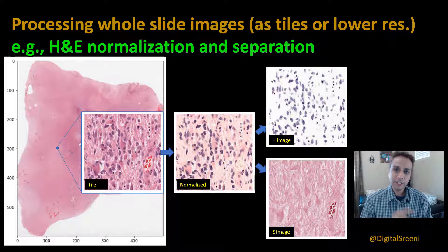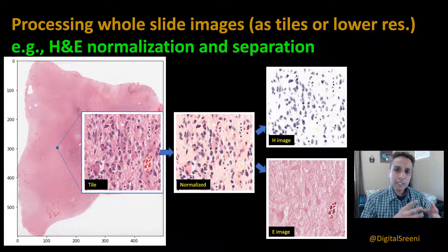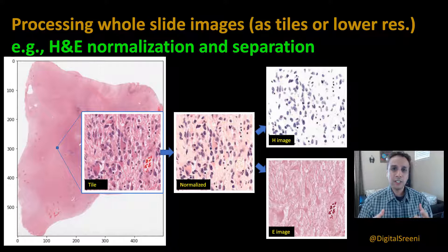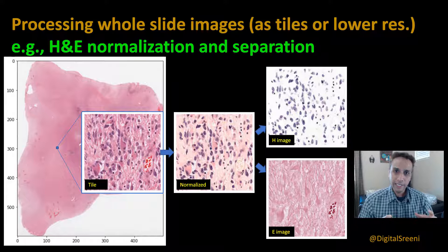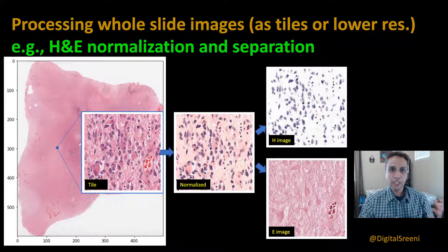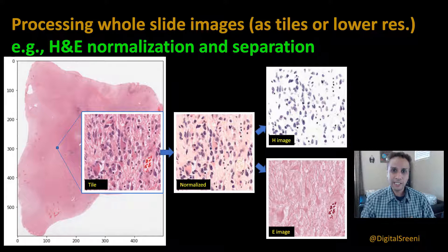Hey guys, welcome back to Digital Screening channel on YouTube. I hope you watched the previous video, because I introduced the topic of OpenSlide and we used OpenSlide to open a whole slide image. For visualization purposes we resized it to smaller resolutions and learned about different levels within that whole slide image, meaning different resolutions stored as part of it. We ended that video by talking about how we can divide this large image into smaller tiles of a specific size — we saved 256 by 256 resolution tiles to our local drive.